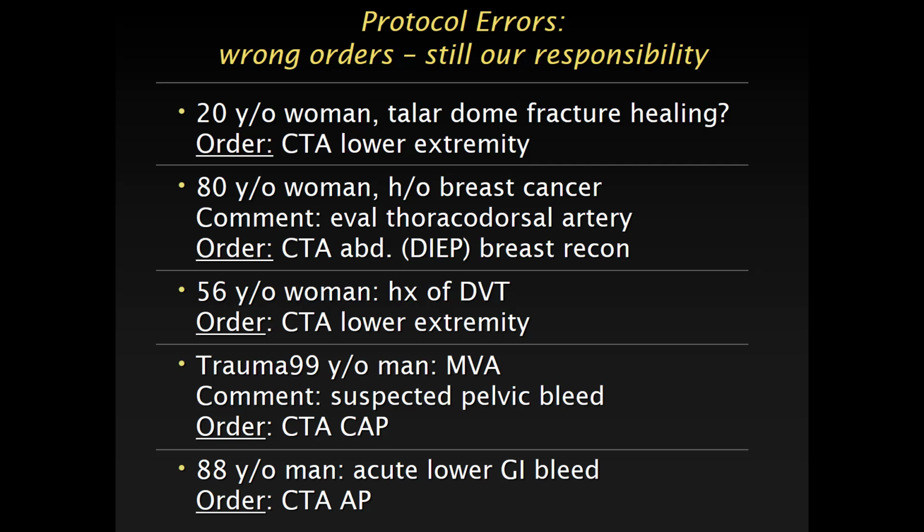So that's also a major issue, because then you can't actually interpret the whole study, right? And the other problem is if it ends up on the cardiovascular imaging board, you cannot turf it back to the body folks, because there's not even a portal venous phase. If there were a portal venous phase, you could ask, can you help me? But otherwise, with the CT angio alone, unfortunately, it's in our court. You cannot interpret these studies.